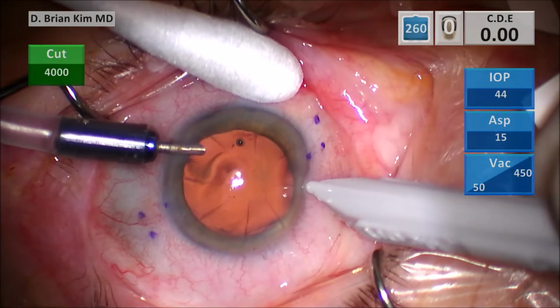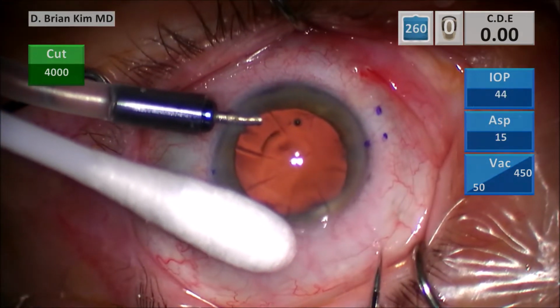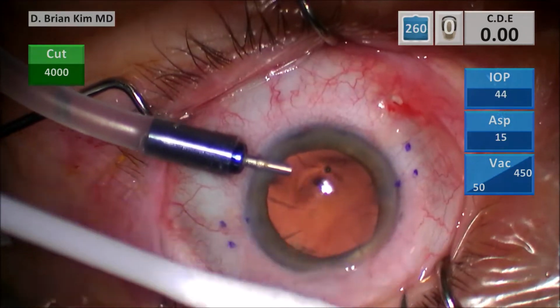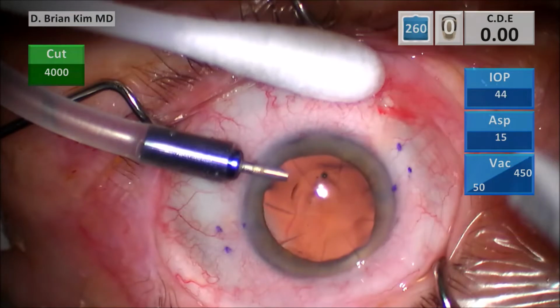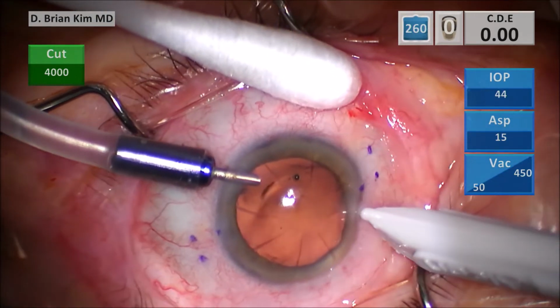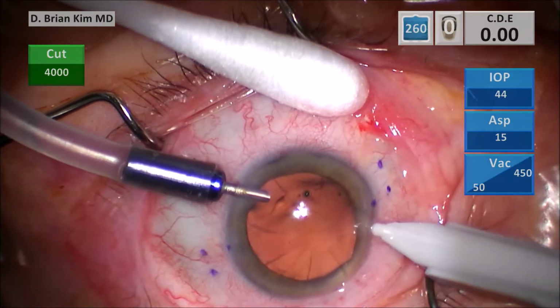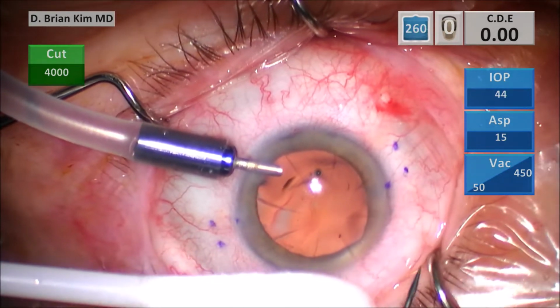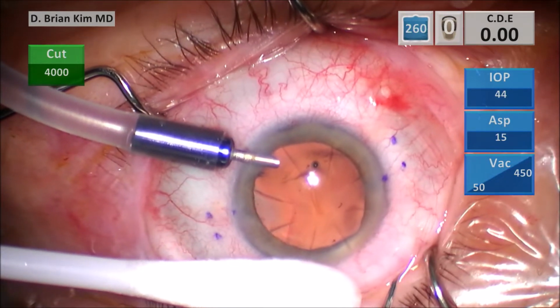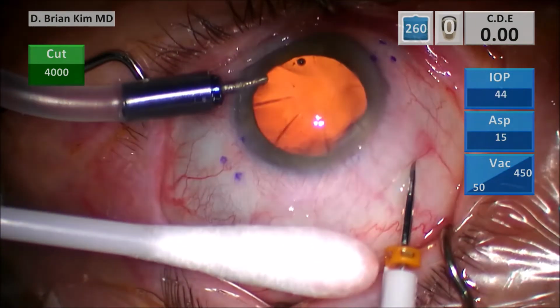I go ahead and indent in a more easy, ergonomic location to do the vitrectomy. Again, I placed the trocar inferonasal so I can lift the lens, but again, the nose is in the way. It's not really very easy and practical. So what's cool is go ahead and put the needle back in, take the trocar out, and now I've repositioned it in a place that's more natural, more ergonomically easy to do. So I go ahead and tunnel in my typical self-sealing technique.